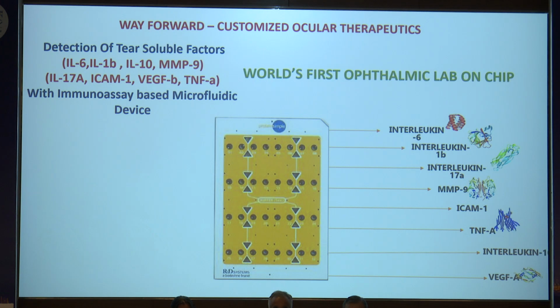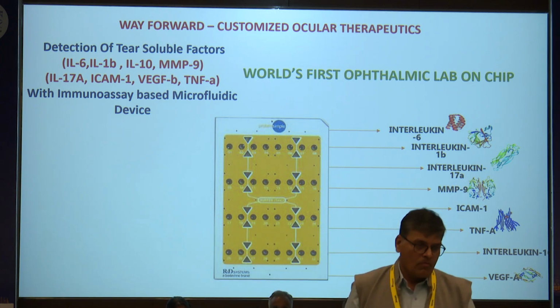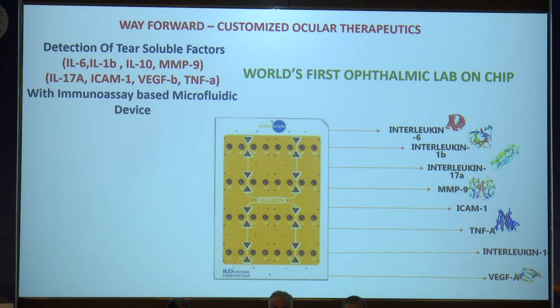So this is our first ophthalmic lab on chip, which we are trying to include in our day-to-day practice, which also helps in the tear molecular factor analysis in the future.